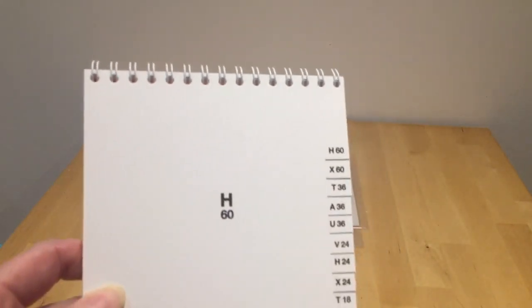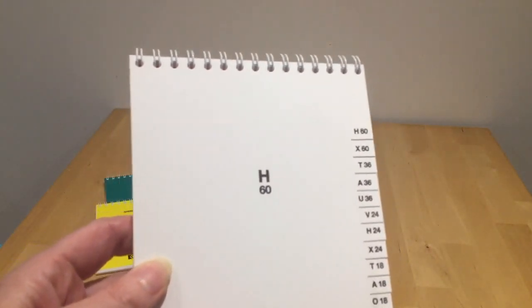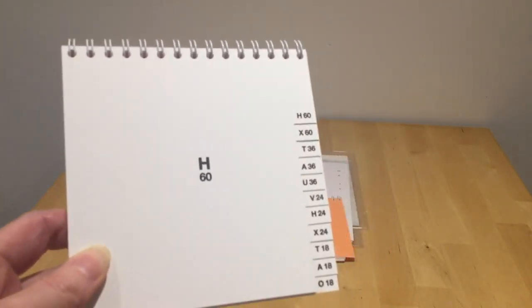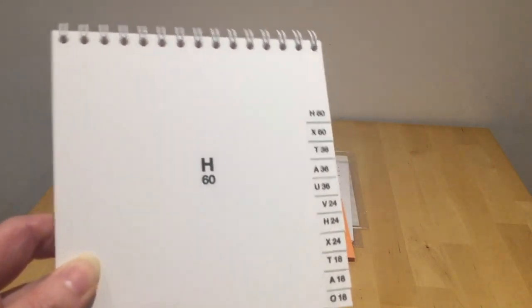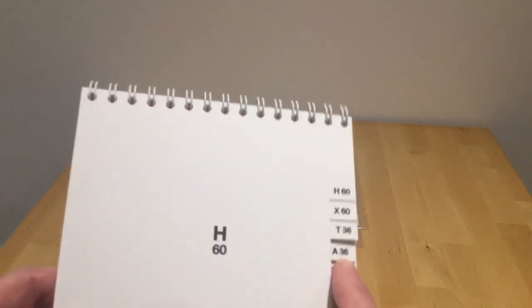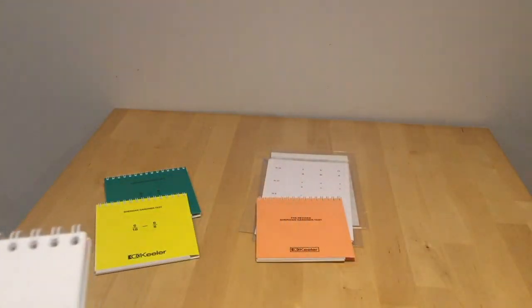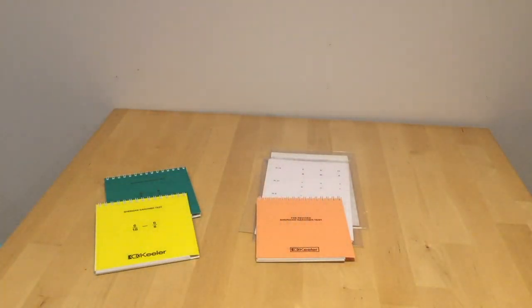So again, you can decide whether to give every single letter at value 60. There is a limited range of letters used in this test. Or you can decide if you're going to skip on. Let's do A at 36, flip over, and there it is. So capital letters, and this goes to 18, A at 18, and O at value 18.